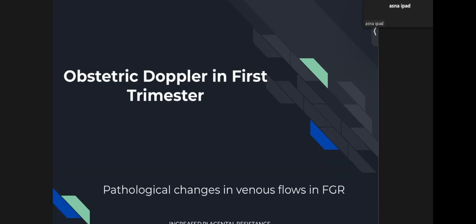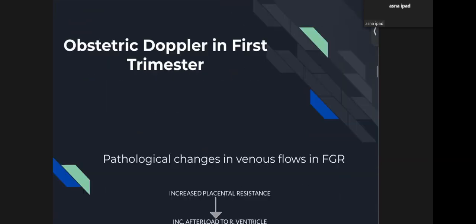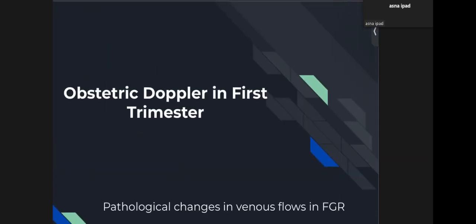So we have reached the Doppler of the first trimester. In the first trimester, the only important scan we do is the NT scan, at 11 to 13 weeks plus 6 days. That is when we do the NT scan. The NT scan is not just seeing the NT and saying okay, NT is normal. That's not how it's done. It's a mini TIFFA scan. It's a complete body anomaly scan.